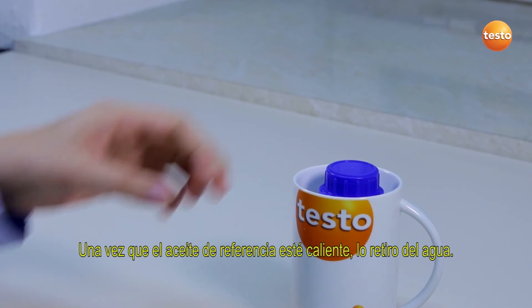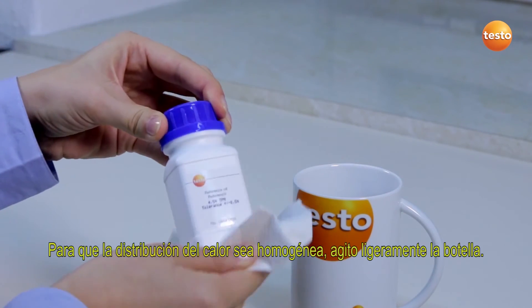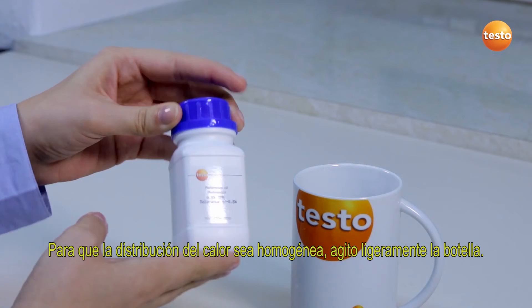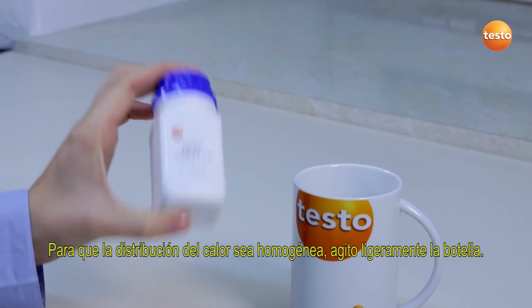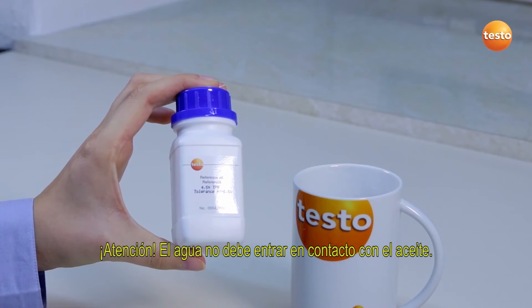Now the reference oil is warmed, I take it out of the water bath. To distribute the warmth more evenly, I briefly shake the bottle. Be careful — the oil may not come into contact with the water.